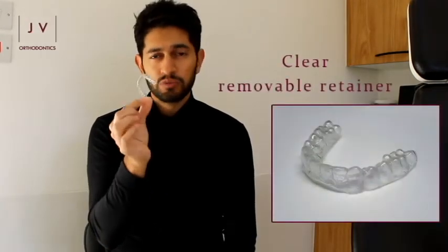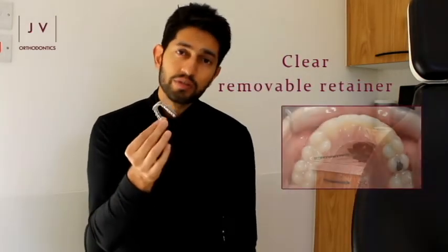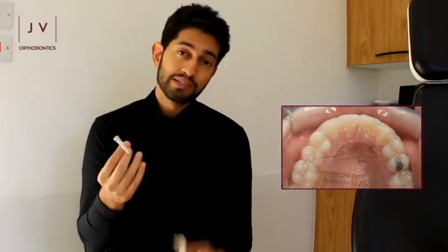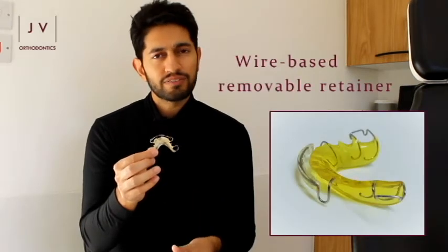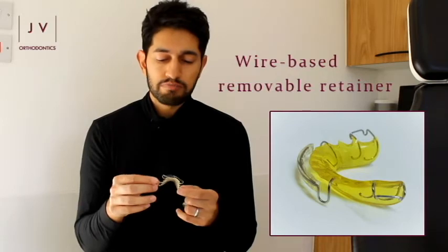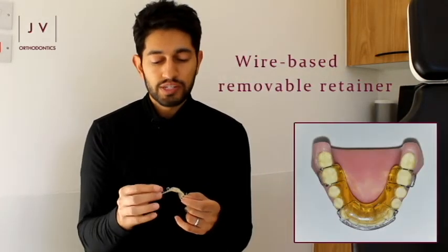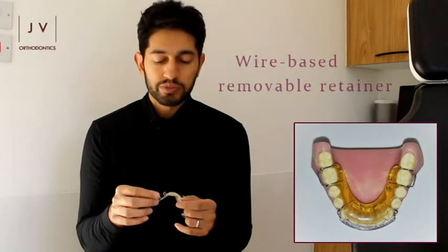With a removable retainer there are lots of different types available. Two of the most common types that I tend to see: one is this, which is a clear removable retainer made from a vacuum-formed material that fits over your teeth once you've had your braces taken off. Then this type here is a slightly different material — it has metal wires which clip on over your teeth and support them in those positions.